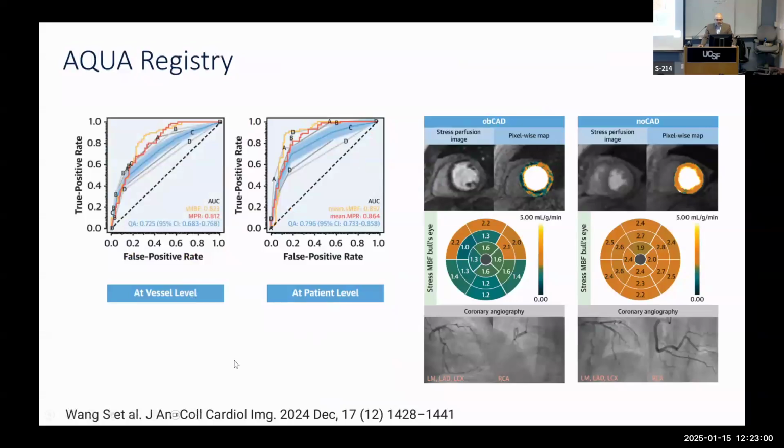And then some recent work just published in JACC Imaging recently. This is a registry that we were part of. This is data from about 100 cases using kind of all comers, a really suboptimal real world kind of experience. And what this study showed is that actually, and this is one of the first studies to show that quantitative analysis actually outperformed the expert readers. A lot of the data suggests that it's actually pretty similar. But what it does also tell you in general is that if you take these techniques and apply them more broadly, you don't necessarily have the world experts as the people who are the readers, and the quantitative analysis can kind of up people's game.